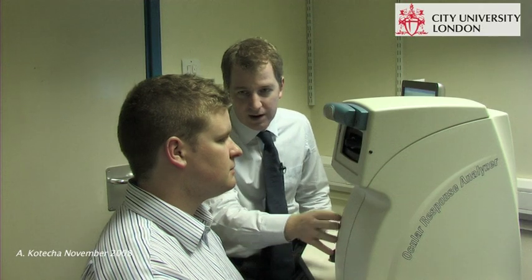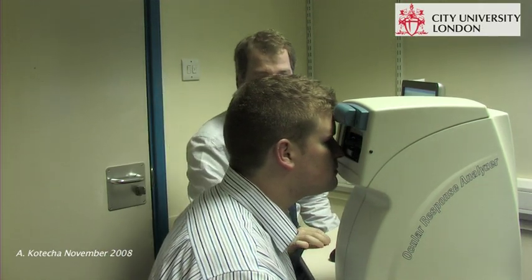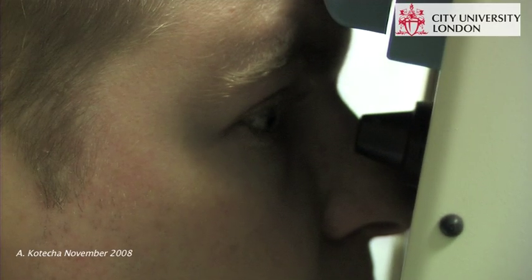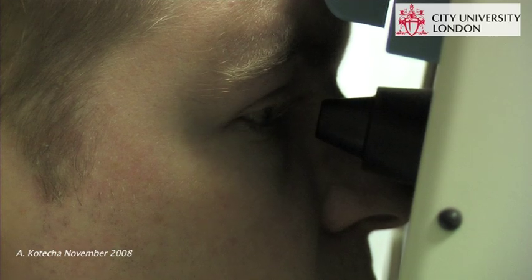Now we're going to measure the pressure of your eyes using this device. If you could come forward and pop your forehead on there, just so your nose touches gently on there as well. That's very good. Now look at the green spot in the middle of 4 red ones. It's going to take 3 readings. Well done.